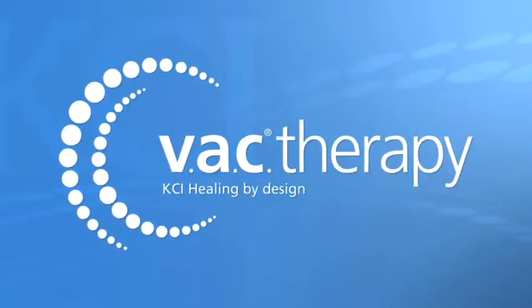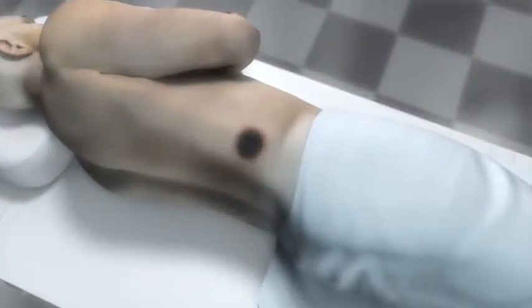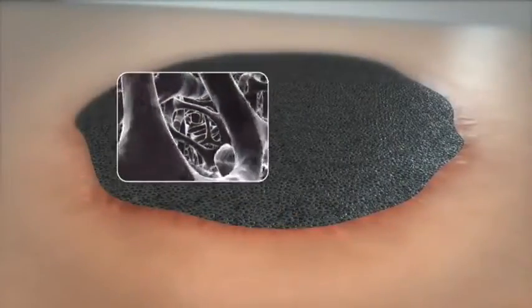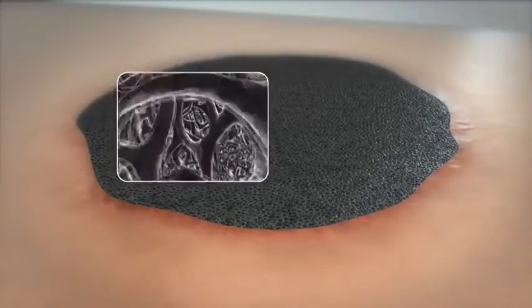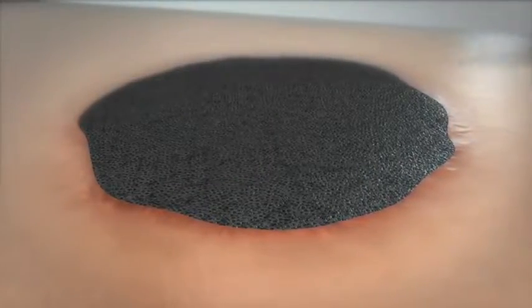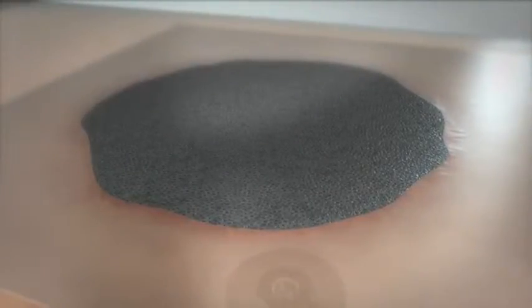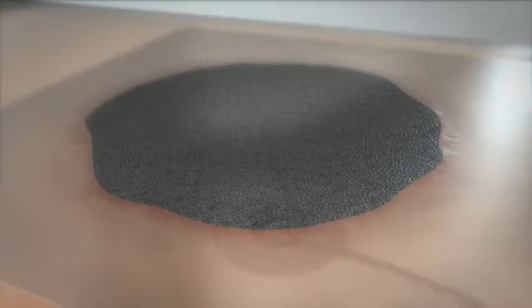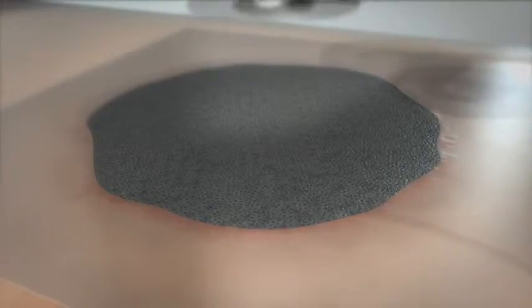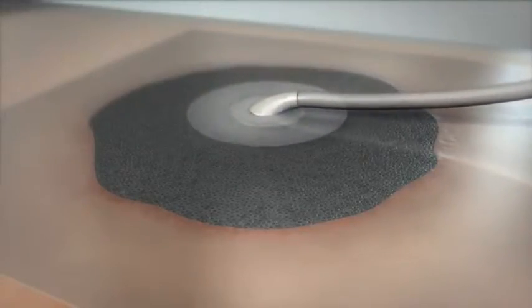in all care settings. When treating a wound using VAC therapy, the KCI proprietary granufoam dressing, which is a reticulated open cell foam, is placed directly into the wound bed. A semi-permeable drape is then used to seal the wound, provide a moist wound environment, and protect the wound from external contamination. The proprietary track pad and tubing are then applied to the drape and provide the connection to the therapy unit.